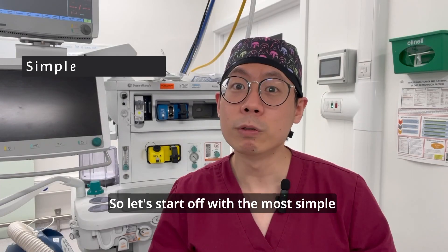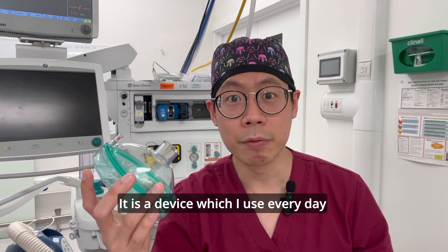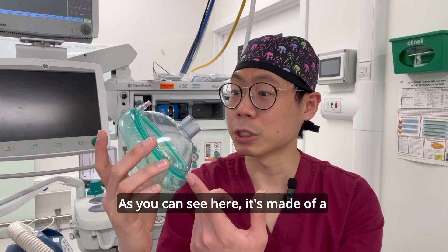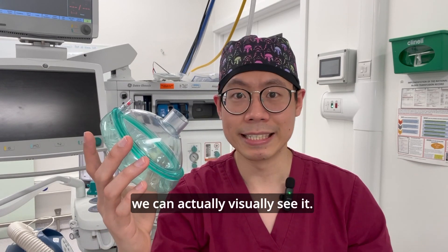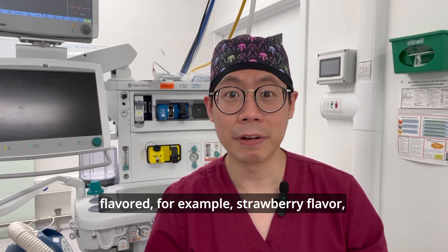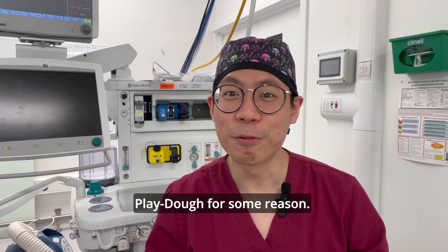Let's start off with the most simple airway device, which is the face mask. It is a device which I use every day before I drift my patients off to sleep. As you can see here, it's made of a transparent plastic so that if there's any vomit or secretions into the mask, we can actually visually see it. Some face masks actually come flavored — for example, strawberry flavor — but this mask in particular smells like Play-Doh for some reason.